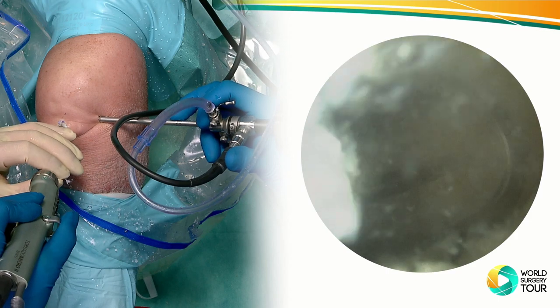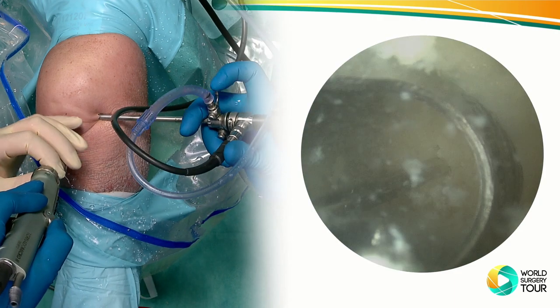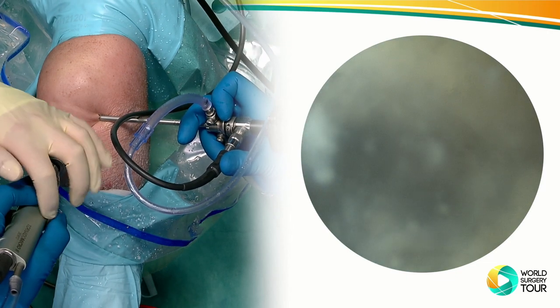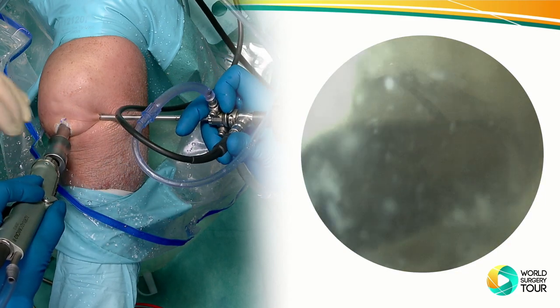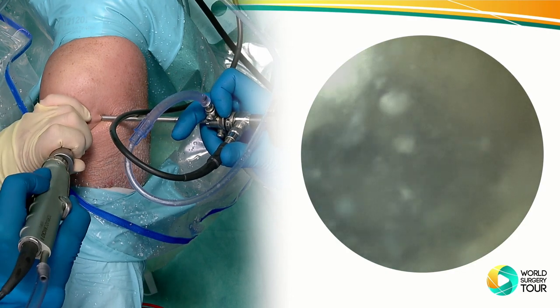Is there an outflow cannula or something that we can remove the fluid? Okay, here we go. Because I cannot remove it with a pump, it doesn't allow me to remove the fluid. Maybe open the suction a little bit more. But there's no suction. It runs, but there's no suction. Okay, I have an idea.